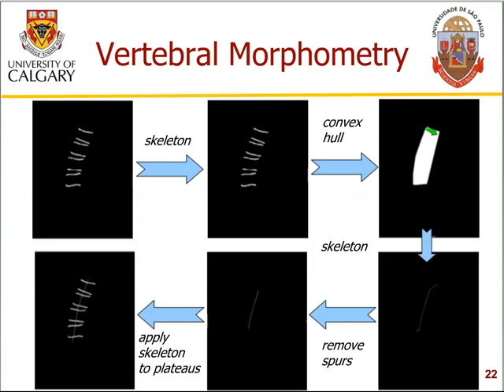If you pay close attention, you may see a line deviating from the main axis here. And these segments were removed by a filtering procedure called spur removal or hair removal. And in this image, you see, if you pay close attention, a single pixel thick line that corresponds to the skeleton or medial axis of the convex hull.